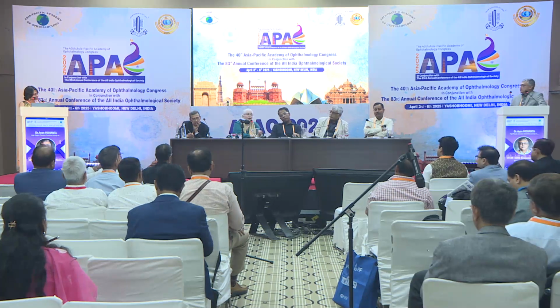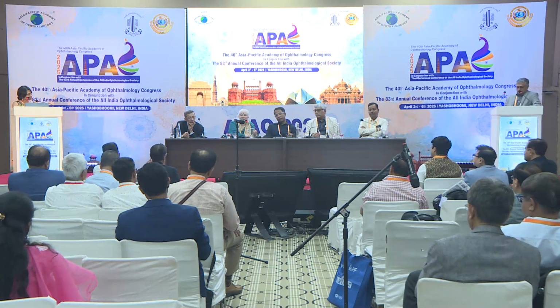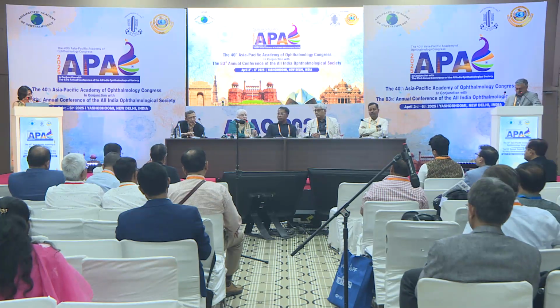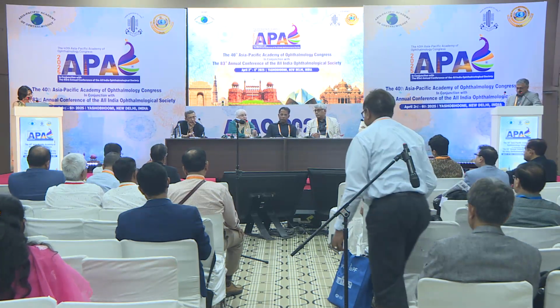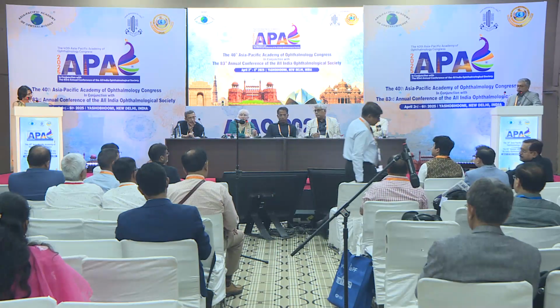Second, the type of myopia. Because I deal with a lot of children, we have lenticular myopias, especially in ROP. It is not an axial myopia. Sometimes they have mixed myopia. It may be just index myopia. And of course, if it is an axial myopia, especially in children, I have to be very sure that this is not a case of Stickler syndrome, because there the whole ballgame is different. They need very proper evaluation, and in many of those cases I do a lensectomy with intraocular laser and vitrectomy rather than putting an IOL, and then they really get very bad detachments.